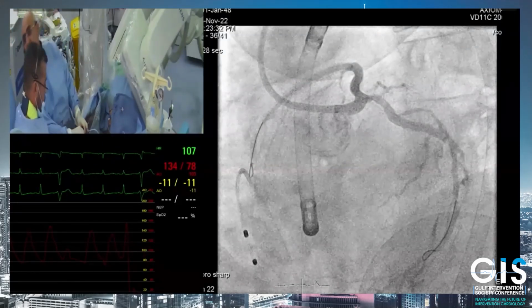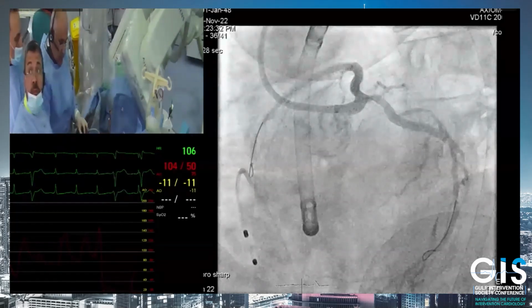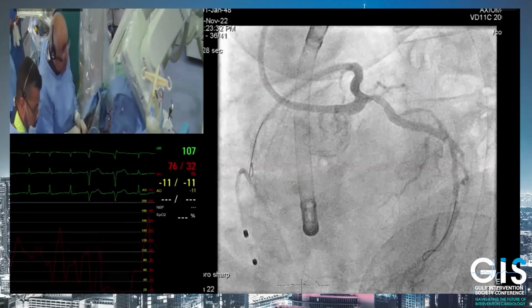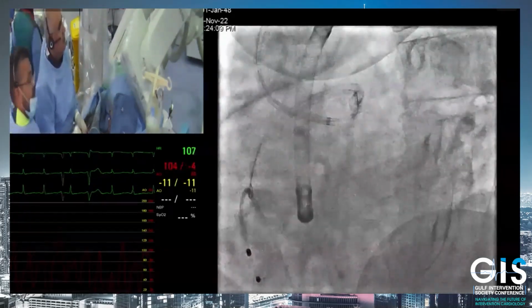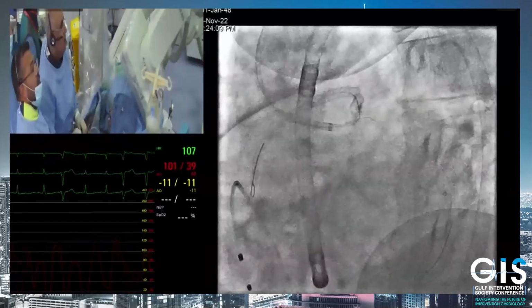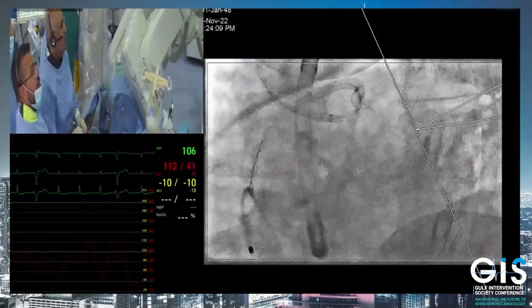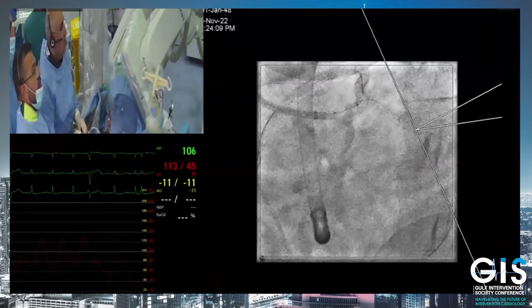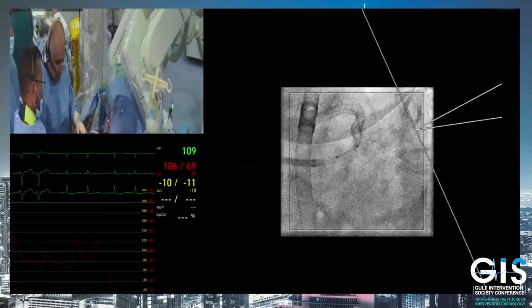Just explain to us, how many minutes did you take for the stenting? Five minutes, ten minutes more. Okay, you did the stenting now. What's your next move? I'm potting the left main ostium, and I removed gently the jailed wire, which I don't believe is quite jailed because it is just a 4.0 stent. So I will use it just as a landmark for me, and then I remove that wire.